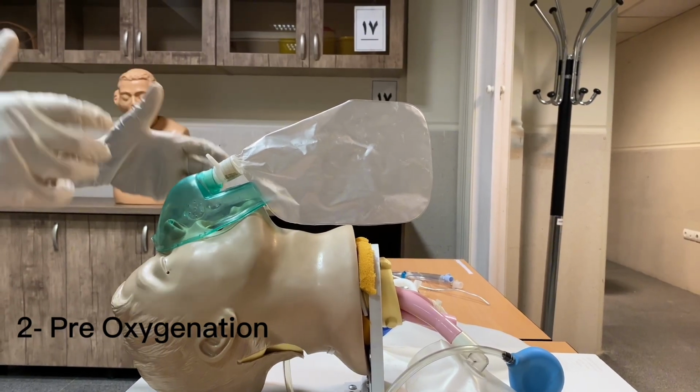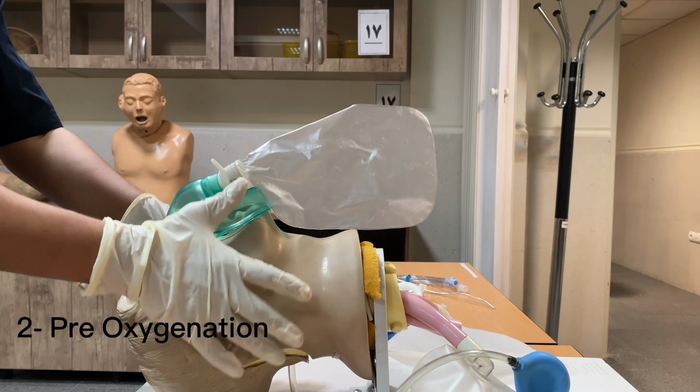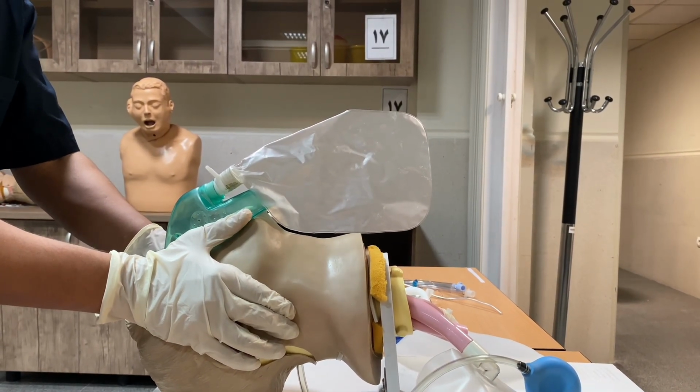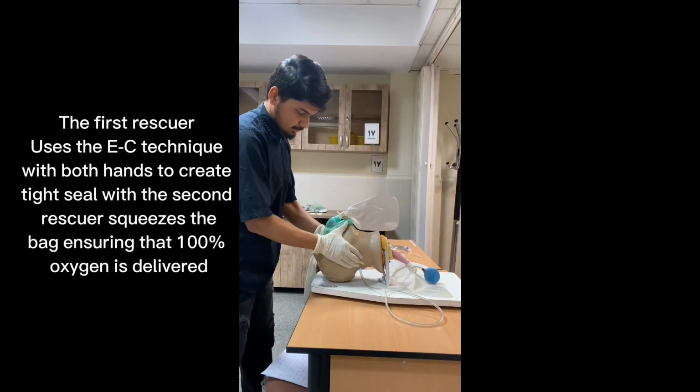The second step is pre-oxygenation. In this step, we will provide 100% oxygen to the patient for 3 to 5 minutes in order to maximize the oxygen reserve in the patient's body.